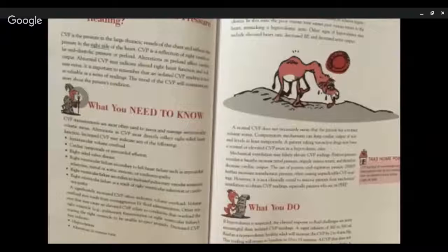Mechanical ventilation may falsely elevate CVP readings. Positive pressure ventilator breaths increase atrial pressure, decrease venous return, and therefore decrease cardiac output. Use of positive end-expiratory pressure further increases intrathoracic pressure, often causing unpredictable CVP readings.